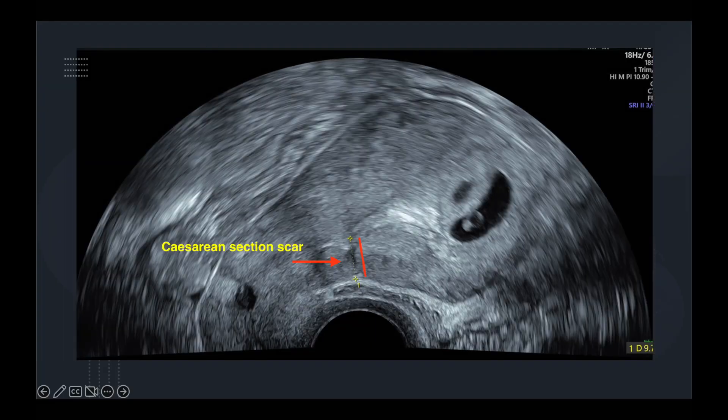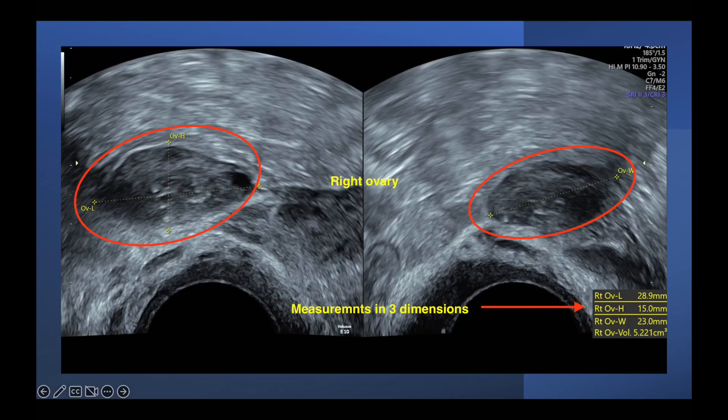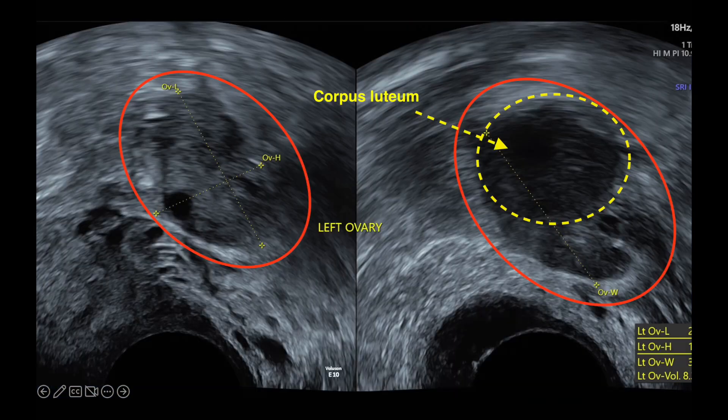This demonstrates the C-section scar, which is measured from the bladder to the central endometrial line. This is a picture demonstrating the right ovary with measurements performed in three dimensions: length, height, and width. Similarly, this is the measurement of the left ovary in three dimensions.